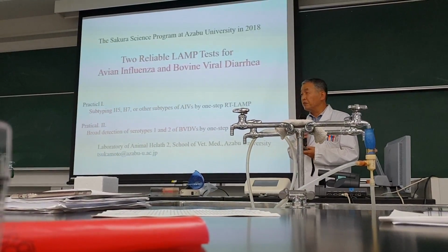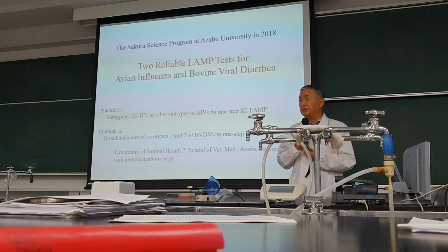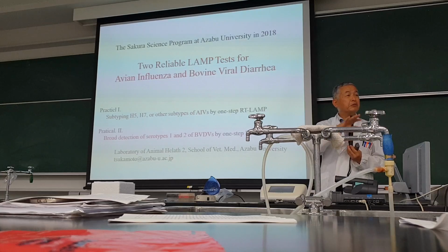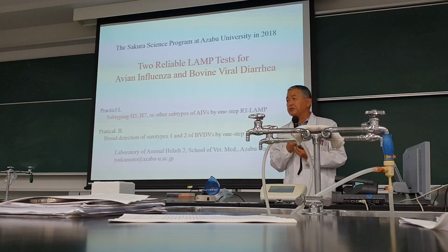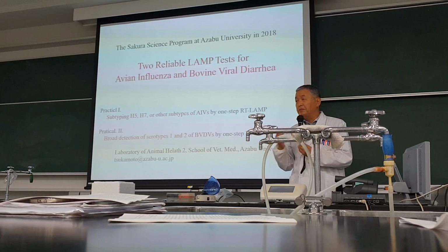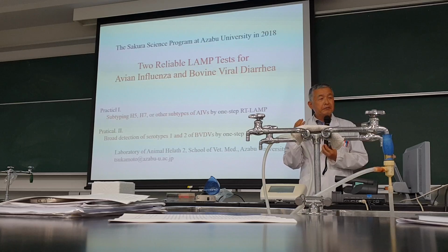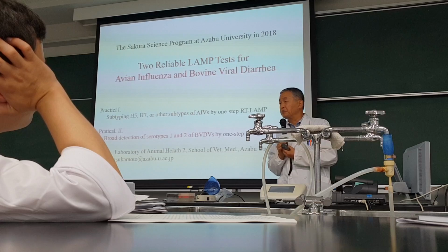What is the new point is that the influenza genome has a big diversity in the gene pool. Sometimes it is difficult to identify these strains broadly. So we have to use a specific primer set to cover every strain. After some struggle in research, we finally got some of the primer sets. It is called population primer.